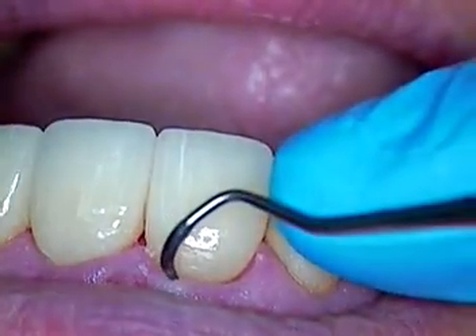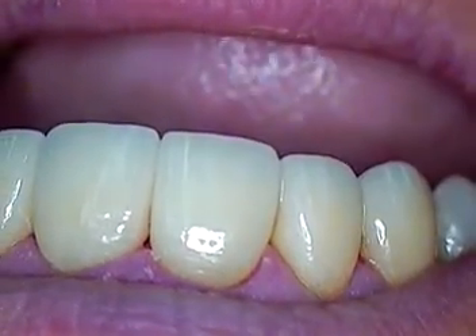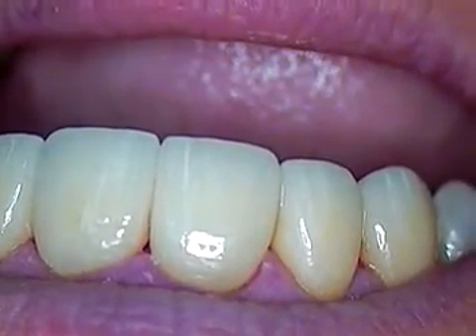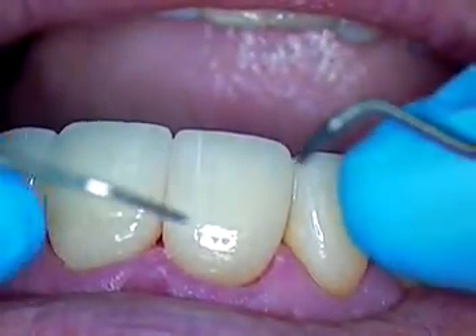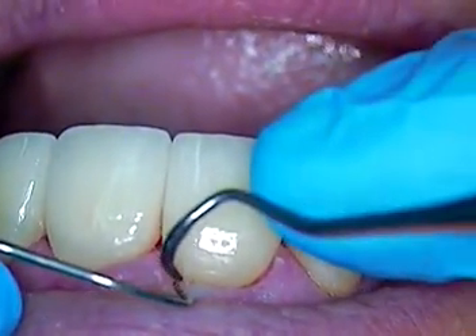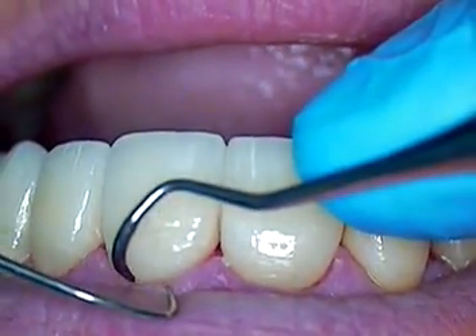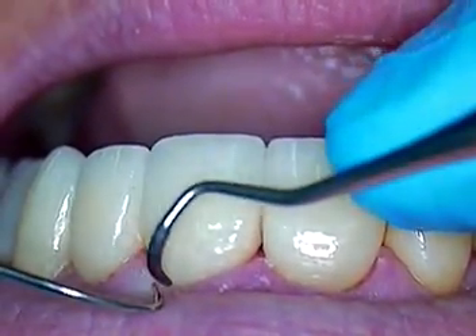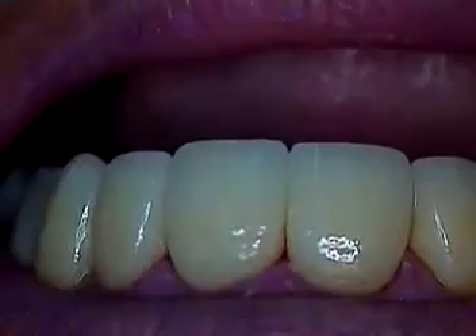Come in a little closer. You can see you want to take your scaler and try to move the tissue out of the way with an instrument. You can also use a 12-blade scalpel if you wanted to go in and remove some of that cement. We thoroughly examined the papilla area and the interproximal area of these teeth, and went through and adjusted the occlusion.